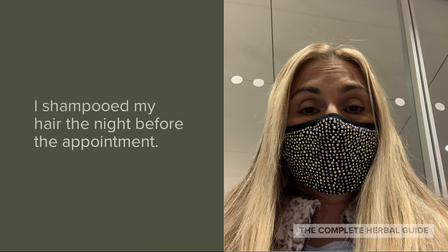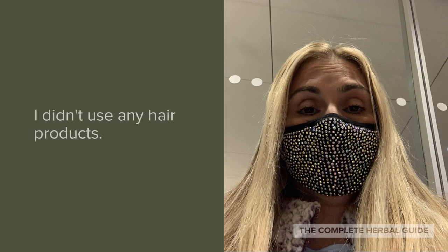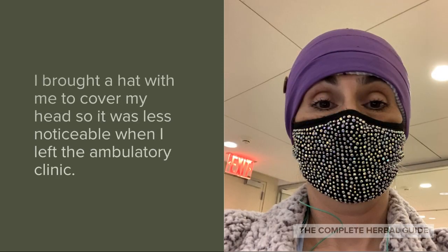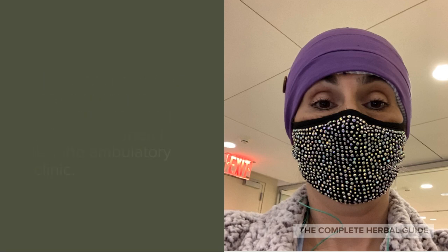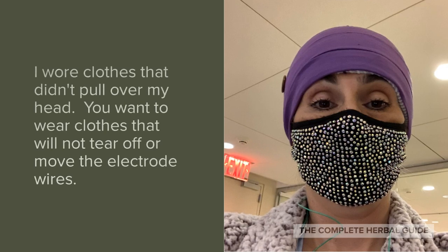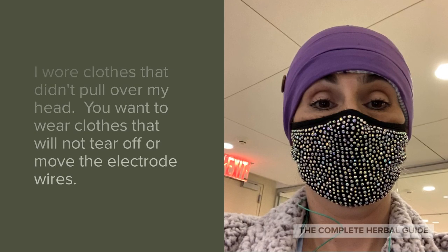How did I prepare for the ambulatory EEG? I shampooed my hair the night before the appointment. I didn't use any hair products. I brought a hat with me to cover my head so it was less noticeable when I left the ambulatory clinic. I wore clothes that didn't pull over my head. You want to wear clothes that will not tear off or move the electrode wires.